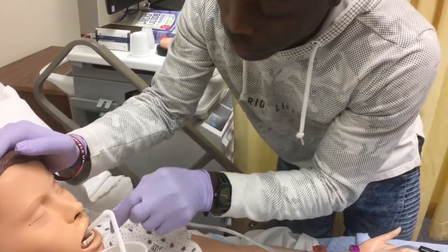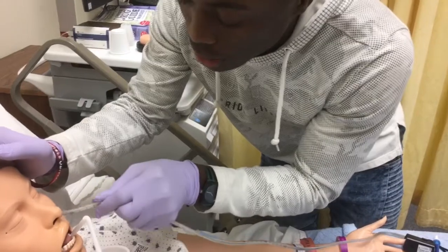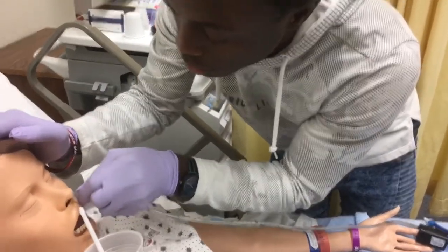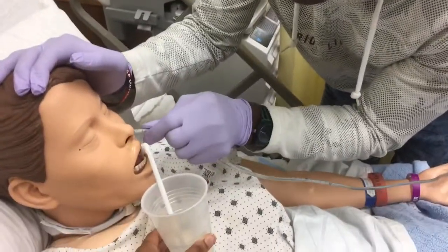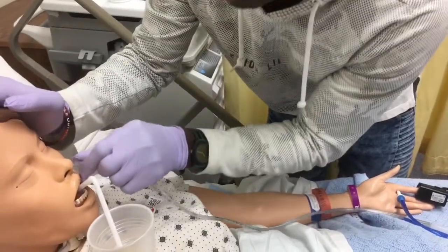Can you take a sip from me? Sip, sip. Can you take a sip from me? Sip. And continue. Can you take one more?